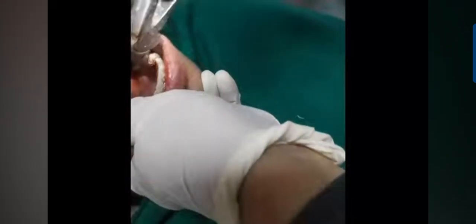Now take the mandibular premolar forceps, and whenever you take out a tooth in the mandibular region, always hold the jaw on the other side with your left hand firmly so that it does not discomfort the patient in the joint, and then give the apical movement in the premolar region. See, apical I have engaged, and then bucco-lingual movement. Slight mesiodistal movement is also required in the mandibular premolar, and then the tooth is out. Always remember the forceps should be engaged on the root and not the crown.